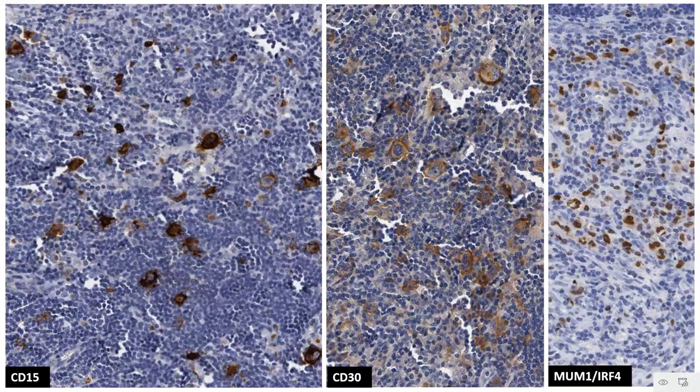What about the immunophenotype? The immunophenotype, of course, in this particular case is the classic one. That is, you have positivity of the membrane as well as the Golgi zone positivity of CD15 in these cells, along with expression of CD30. The CD30 expression in this case is weaker than that of CD15. MUM1 IRF4, that is the post-germinal center marker, is also positive in this large cell population.